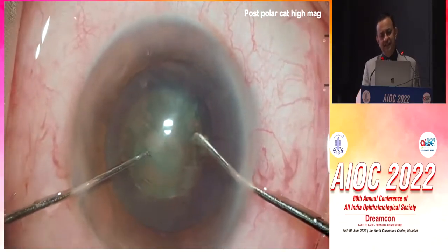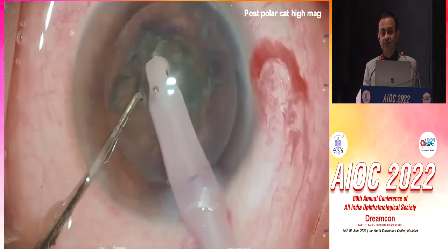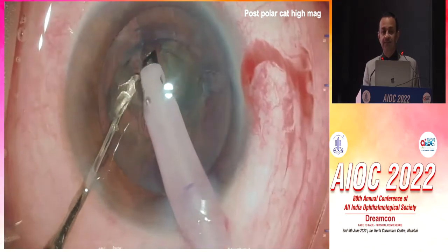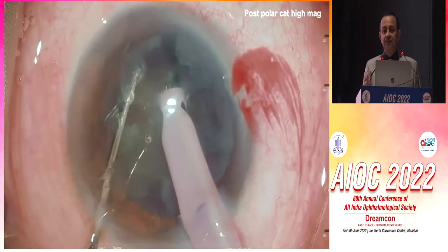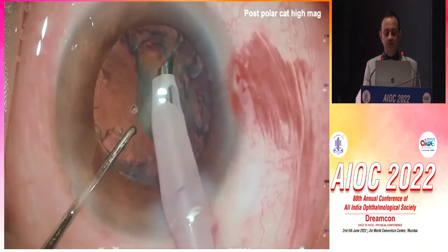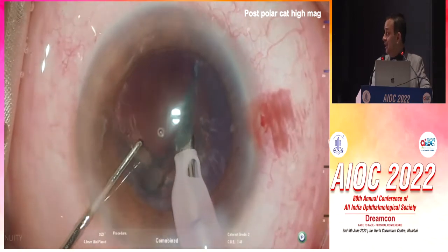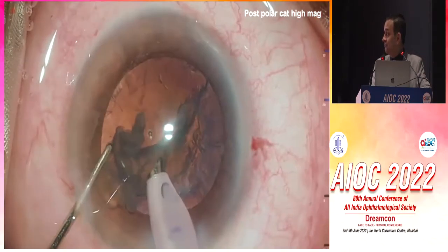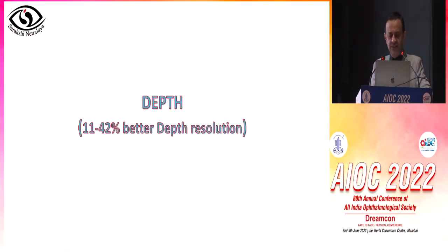On your microscope also you can operate at a very high magnification, but remember, there the depth and the field of view get compromised, and therefore you have to balance magnification versus depth. Here it is not compromised, and you can see the chunk of the material over here, the layers of the cortex you can peel, which are getting peeled off. So this is the magnification at high.